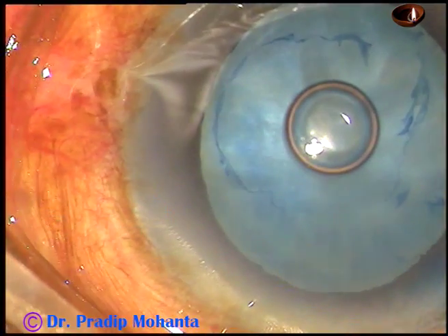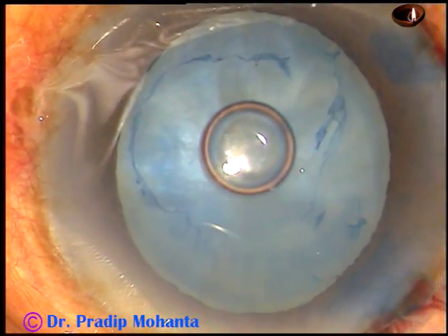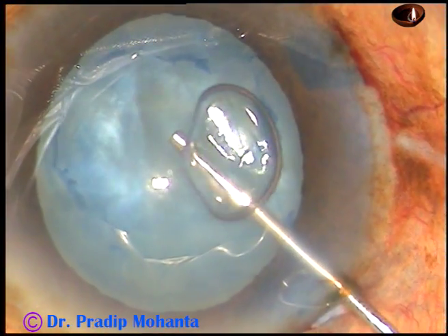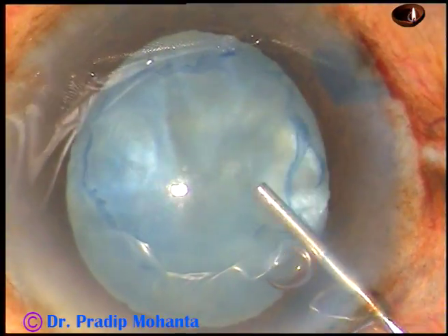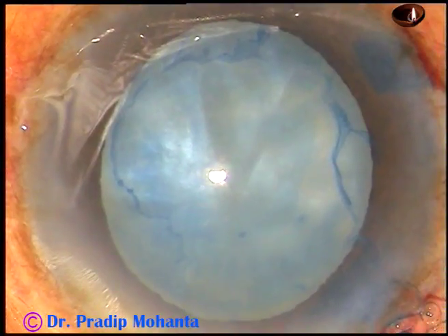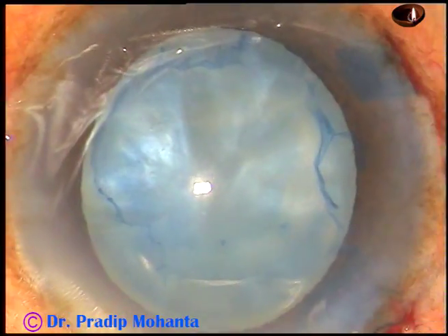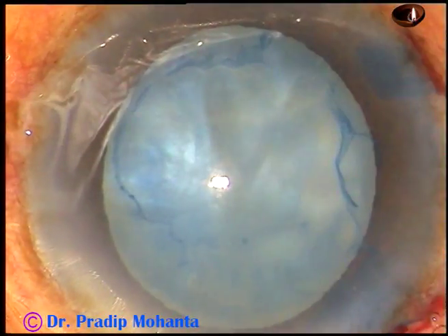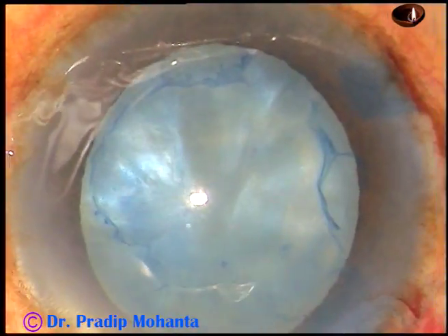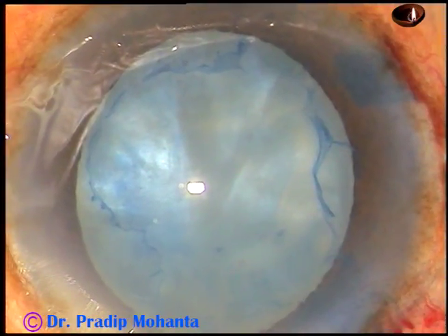You can see some tags on the anterior capsule. This is a little bit of Viscoat from Alcon. Viscoat is a combination of chondroitin sulfate and sodium hyaluronate. Beneath this Viscoat, I am injecting a bit of HPMC.